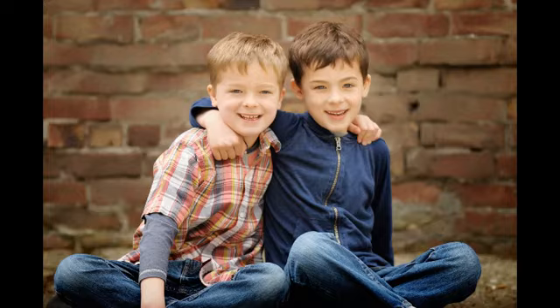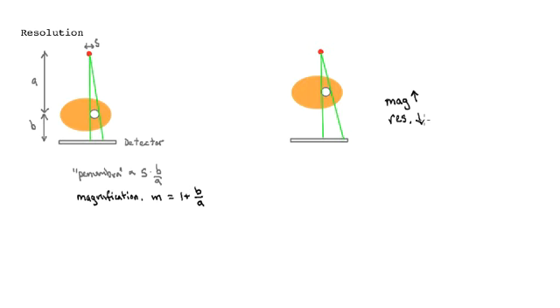So clearly, pixelation is affecting image quality, but there are other factors as well. Remember back to this image that the resolution is affected also by the size of the source. That's a big factor, and where you have the patient as well. So there are quite a few parameters that affect resolution.